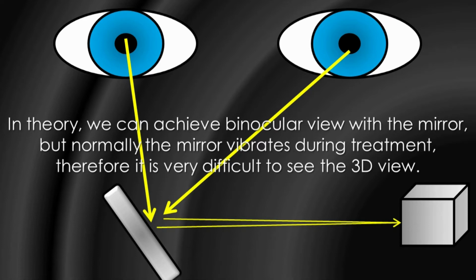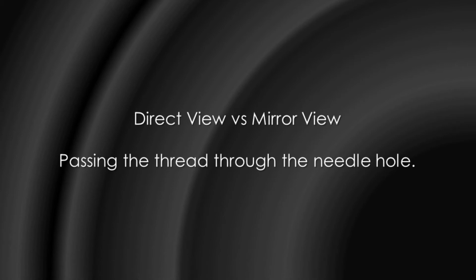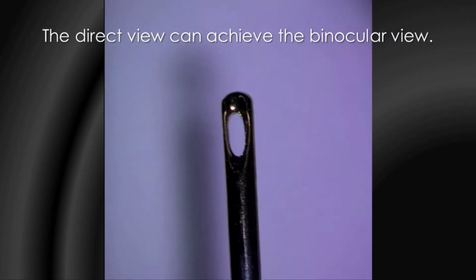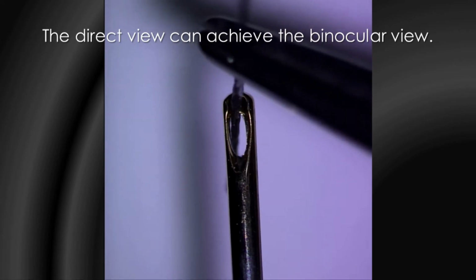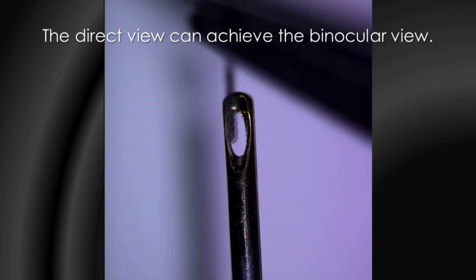Therefore, it is difficult to see the 3D view. Direct view versus mirror view, passing the thread through the needle hole. This is a direct view. The direct view can achieve the binocular view.